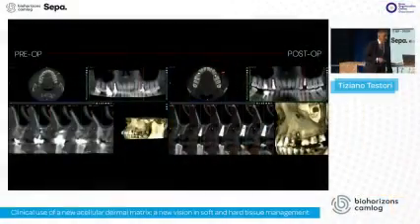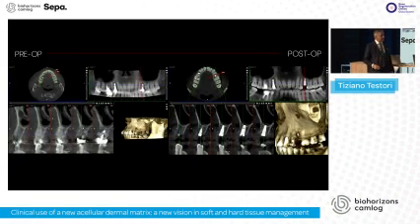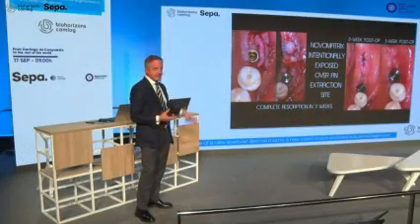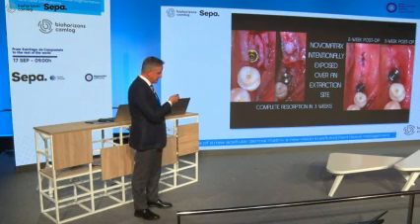This is pre-op and this is post-op in this application, and this is a video. What about if we leave Novomatrix exposed? So we did a case in which we intentionally left a piece of Novomatrix exposed in an extraction site.